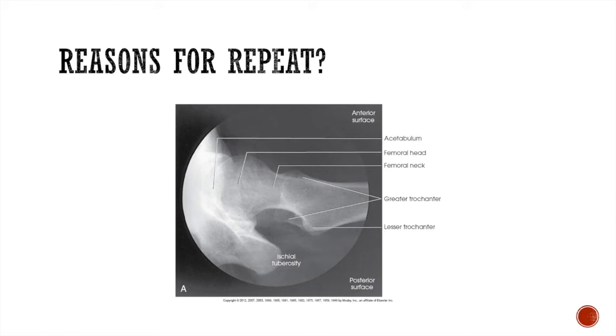If there isn't a compensating filter, then you might want to take one exposure for the femoral head and the acetabulum, and another for the proximal femur. You will have to keep the grid perfectly vertical, as I mentioned previously, because if not, it can result in grid cutoff. And of course, you do not want to place the marker in the anatomy. And this can be kind of hard because you can't directly see the shape of the shadow on the cassette when you're positioning, so you have to be sure to really know where you put your marker. And of course, you want to make sure that the posterior portion of the hip is included on the image.